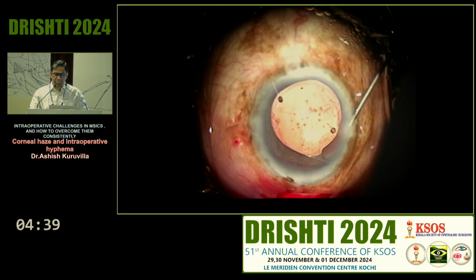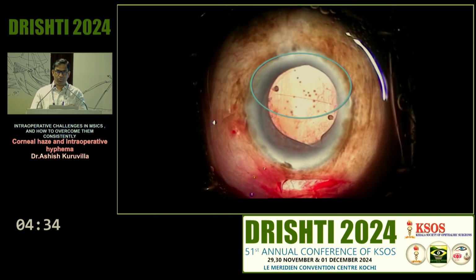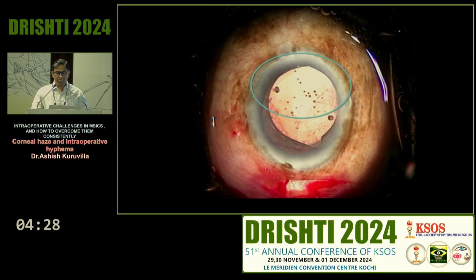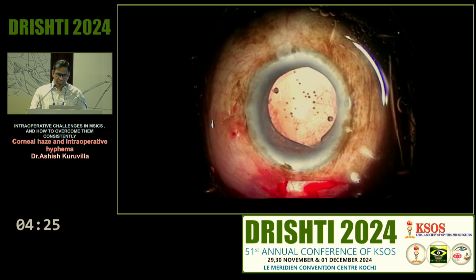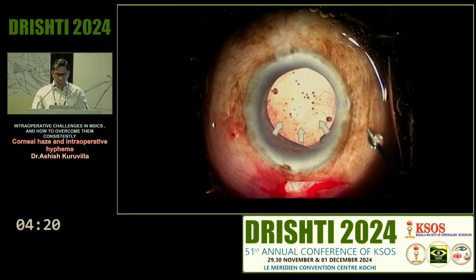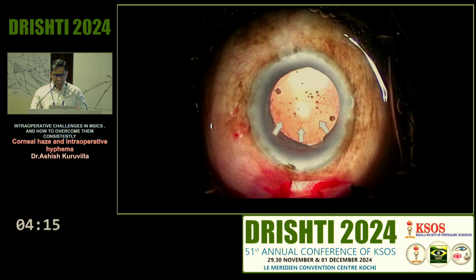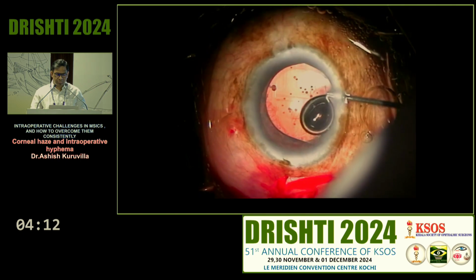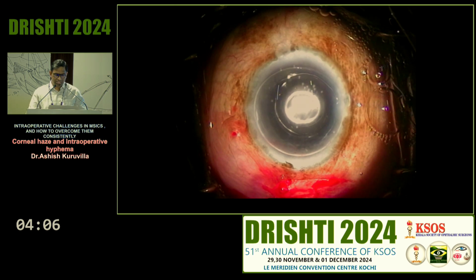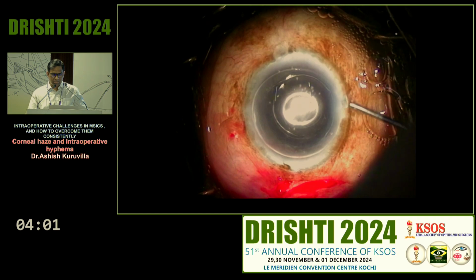And so you must remember that these corneal degenerations are predisposed to Descemet's detachment also. So always you should pay more respect, even when you're doing small steps like introducing instruments, exiting instruments, hydrating. You have to be very, very careful because you can easily end up with a Descemet's detachment. Even in the last step of the surgery, you can end up with a problem like this. So now that the Descemet's is covering the pupillary axis, you will have to rectify that. In this case, since it was a shallow Descemet's, I got away with just putting an air bubble into the AC, keeping the globe nice and tight with that air bubble for about 5 minutes, and that was sufficient to rectify this problem in this particular case.